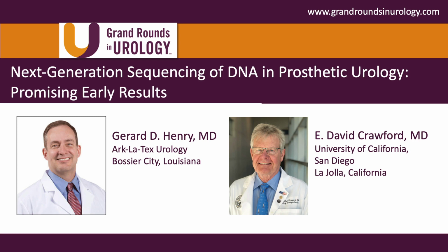But what happens is we know there are more pathogens, and with the information provided when you send it off for next generation sequencing, you can identify, I've heard, 25 or 30,000 different types of bacteria and fungal species. Is that your understanding also? Yeah, I've heard more than 40,000.